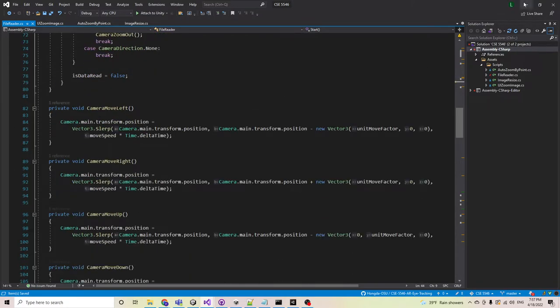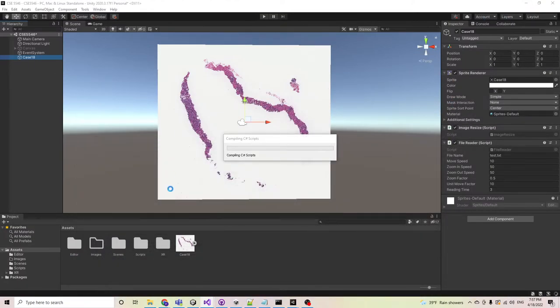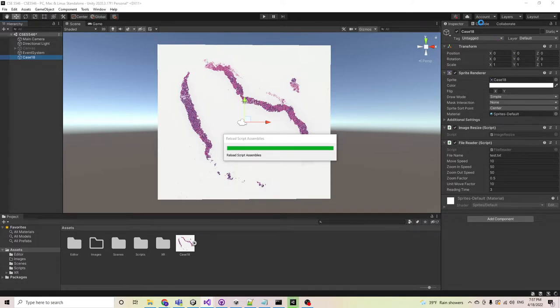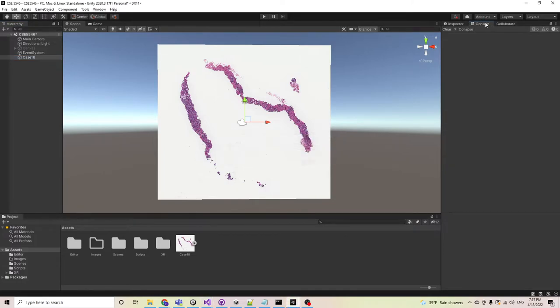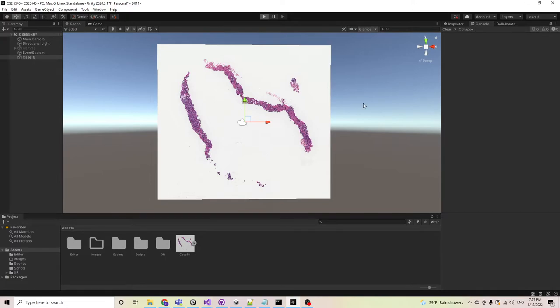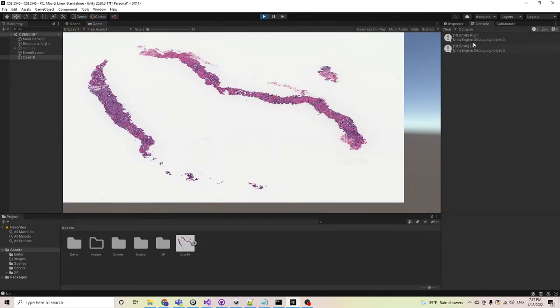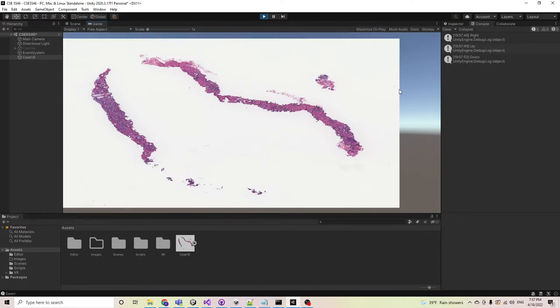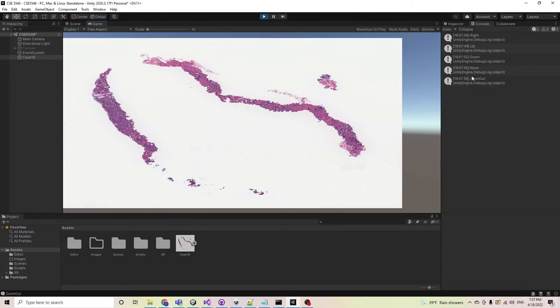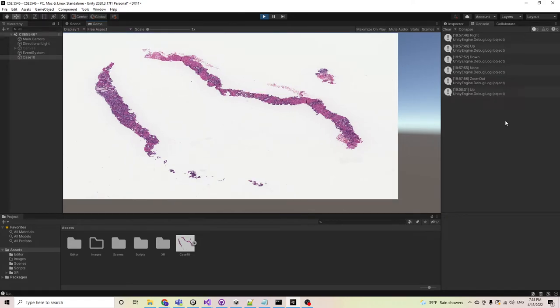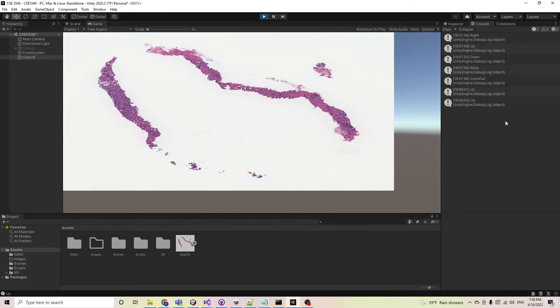As you can see here in the console, when I start the program, when the user is looking at the right side, the image will be moving to the right side. If the user is looking up, the image will go up. If the user is looking down, the image goes down. We also have zoom in and zoom out.